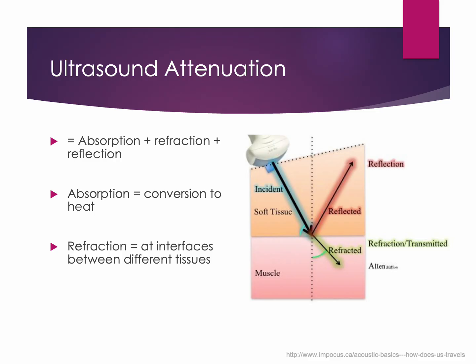The most important of these is absorption. Absorption is what actually creates heat. As the ultrasound wave moves through tissue, it causes the molecules within that tissue to vibrate. That vibration creates friction, and that friction converts mechanical energy into thermal energy. This is the primary mechanism behind the heating effects of ultrasound.